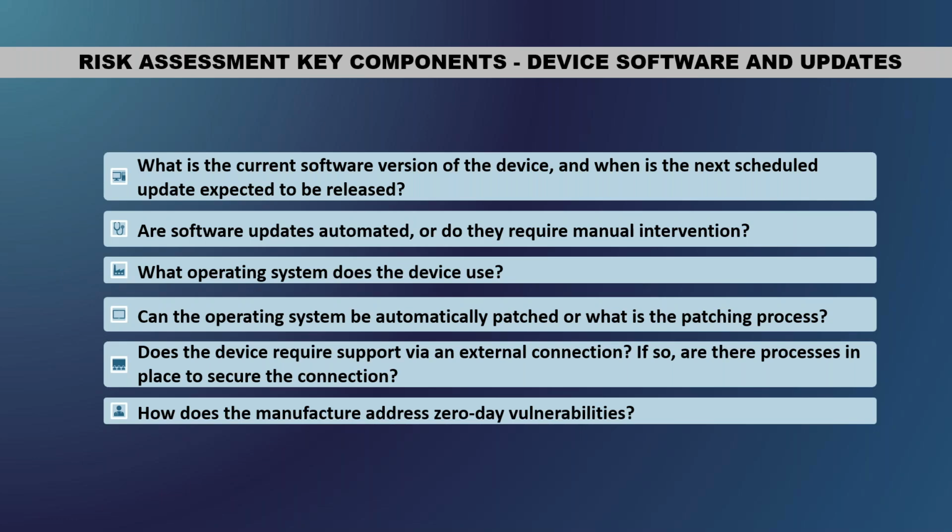The software updates, is it manual, or do you do a manual intervention, or is it automatic? Usually when the vendors say that's automatic, then I start thinking, okay, is it a cloud? Like, how are you accessing our system? Which ties into your network topology, right? Because you're like, okay, how is this system going to be supported?